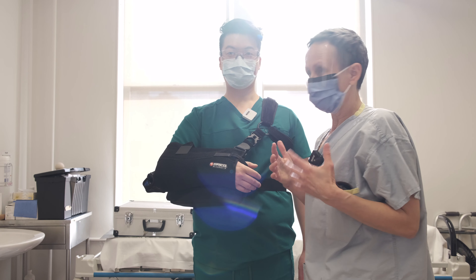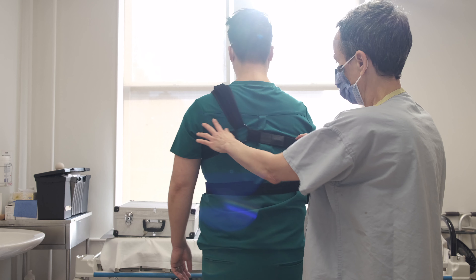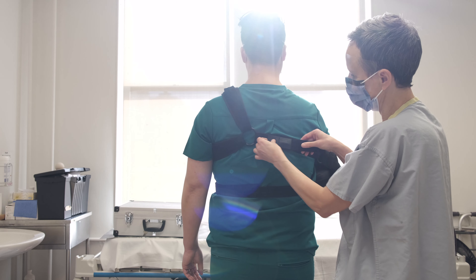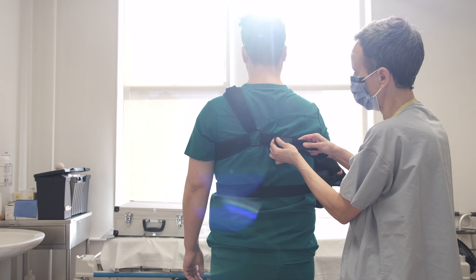Often people say it's still just not quite right, and people keep forgetting this — there's a strap on the back with a velcro too. If I pull on this, you'll feel the position change; it opens up the shoulders. Just play around and see if that makes a difference and gives you good support. There's also a little flap on the sling — see how offloaded that elbow is, it can even let you lean back a little more, so there are no pressure points.